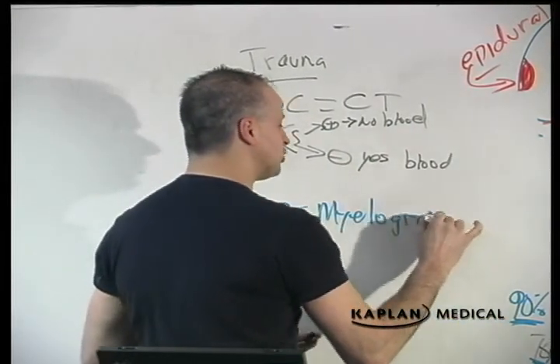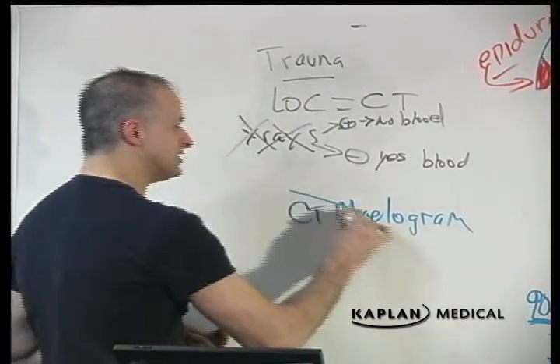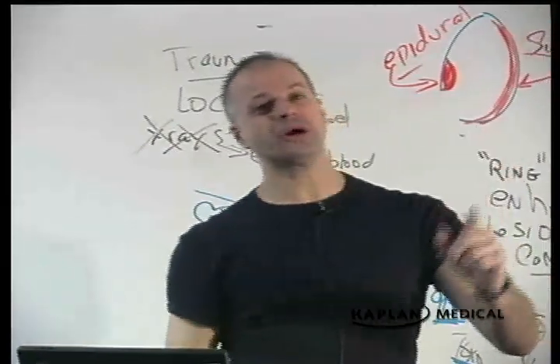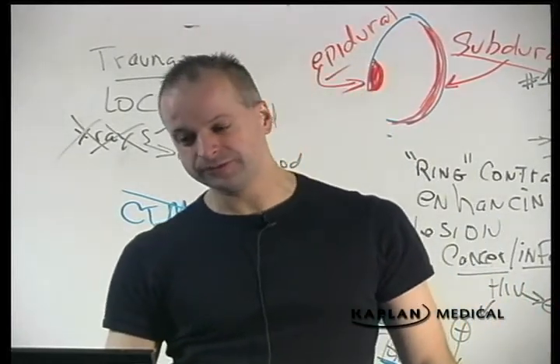The CT myelogram is only useful if you don't have an MRI. This is a dead test and has been replaced by the MRI. Magnetic resonance imaging: more details, no needles in my spine, no being hung upside down.